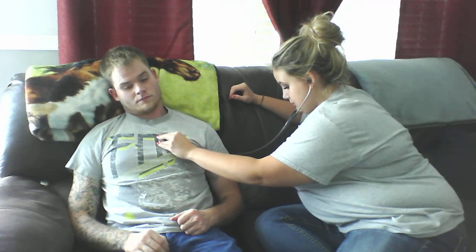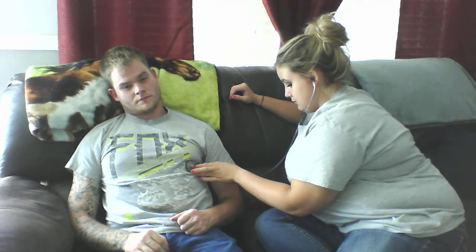We can go ahead and assess some vitals while we're at it. So I'm going to begin with the heart rate. And I can also feel his pulse. Kind of compare the two. I can assess his temperature. So this would go in his mouth if it were clean. Go under the tongue and it would beep when it's done. You can look at respiration, see how many times a minute he's breathing. He appears to be calm, about 16 breaths a minute. And then I can also take his blood pressure.